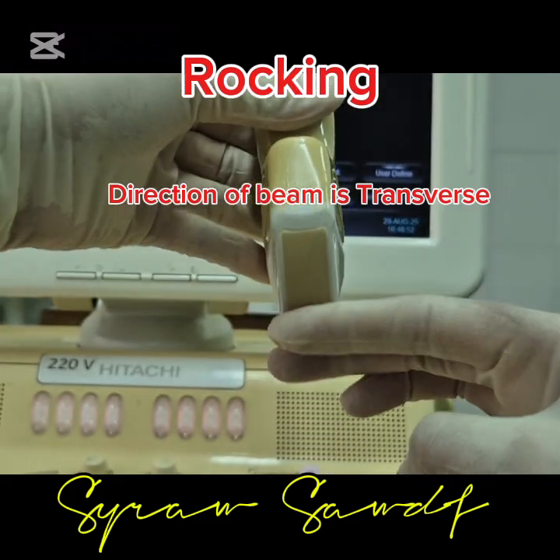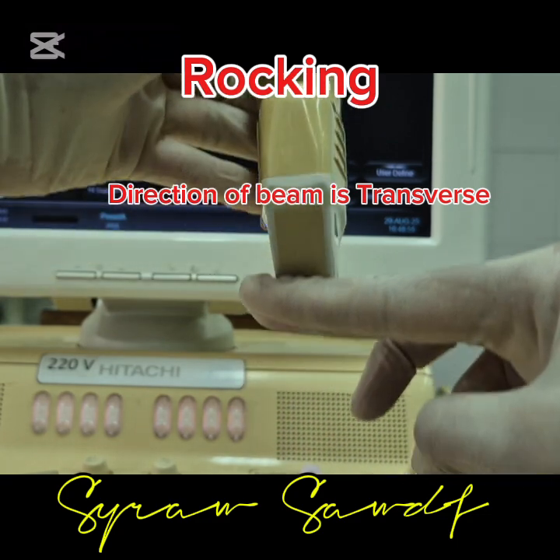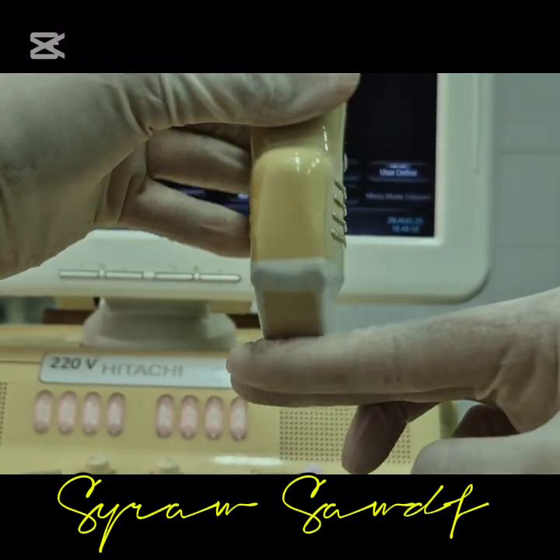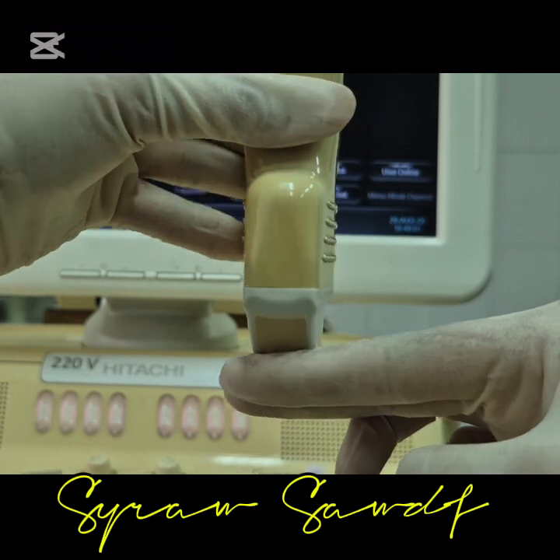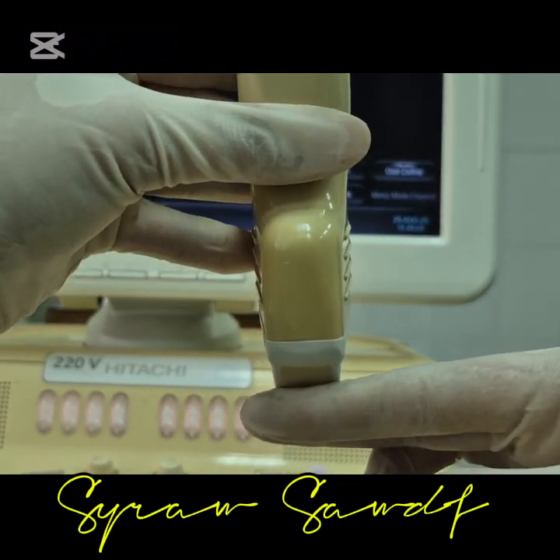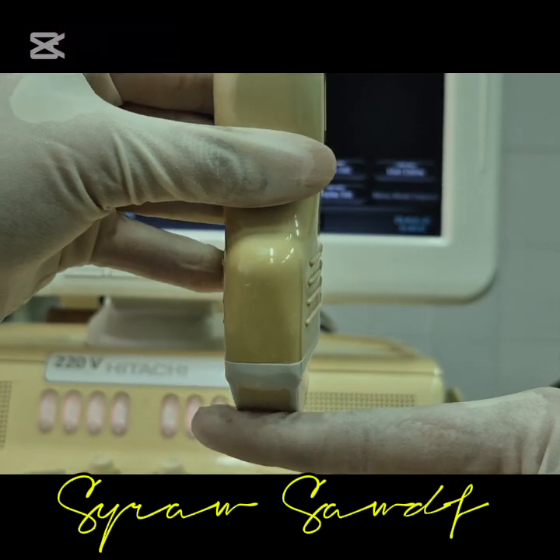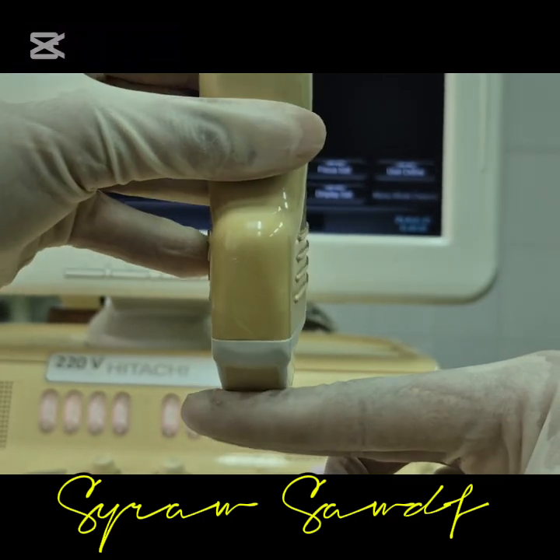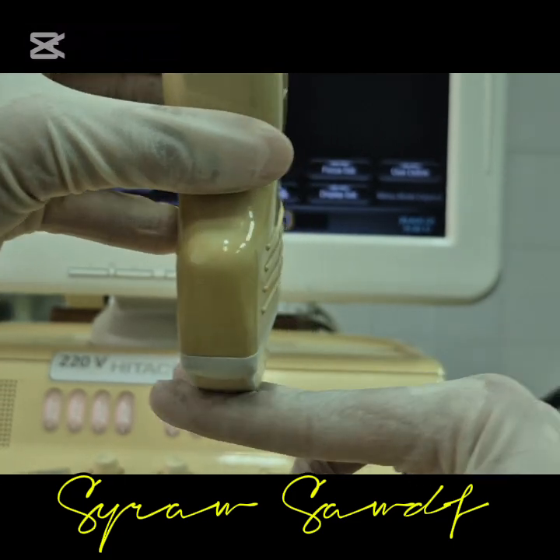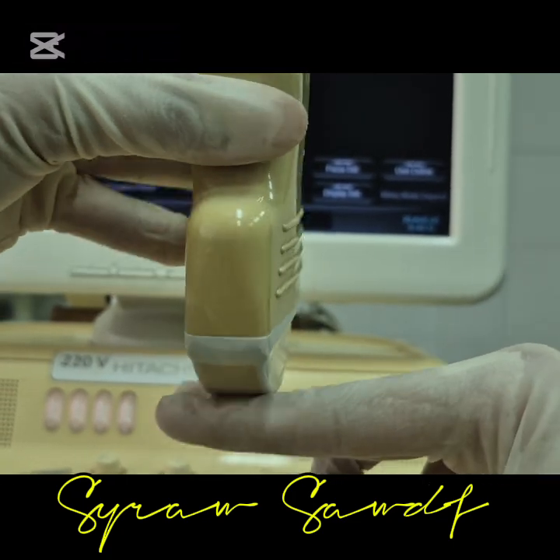So I'm keeping it here, and I am rocking it. So the direction of the movement or angulation I'm giving to the probe is actually parallel to the beam of the probe. Both are parallel, so this movement is known as rocking.